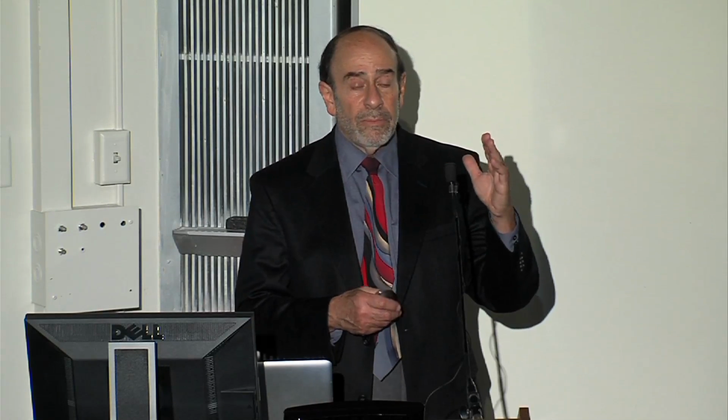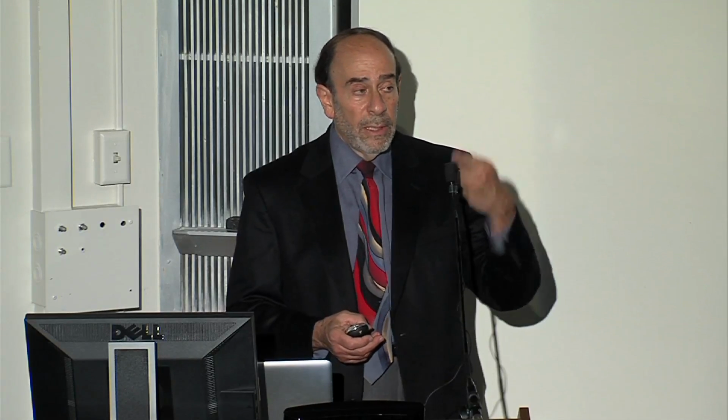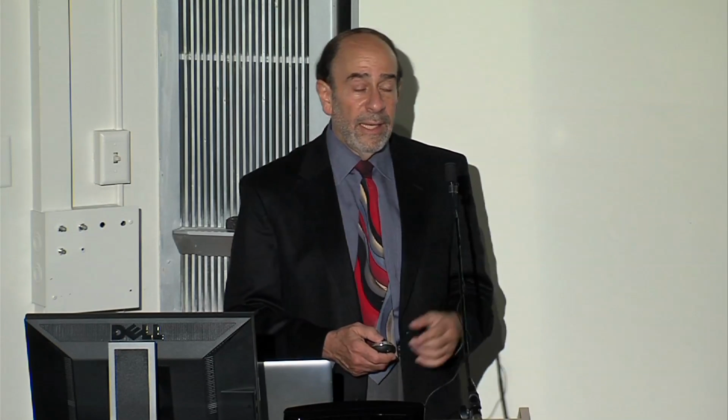And when we bombard it with a radio frequency that's specific for that strength of the magnet and that proton, we can flip them. And then when we turn off the radio frequency, they come back to their resting state and they're wobbling, and they give off a signal. And it's that signal that we detect with antennas that are built into the scanner.